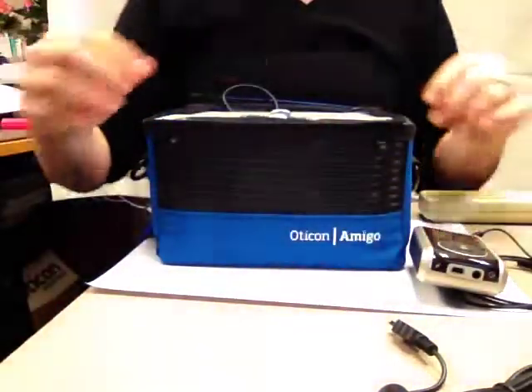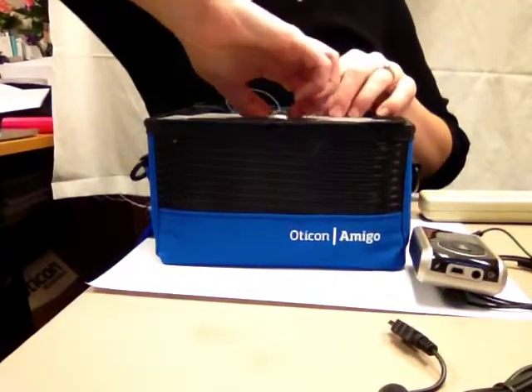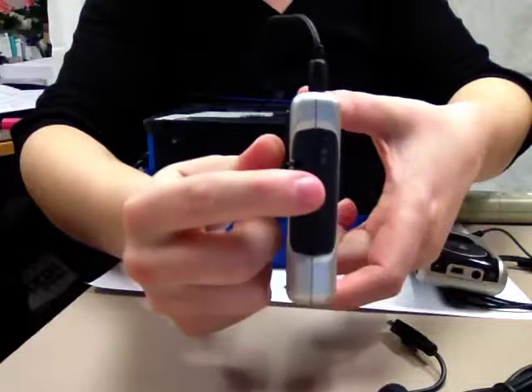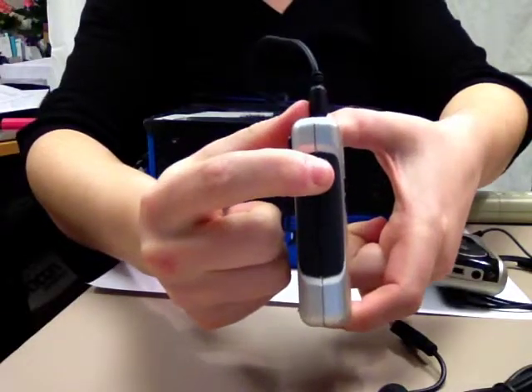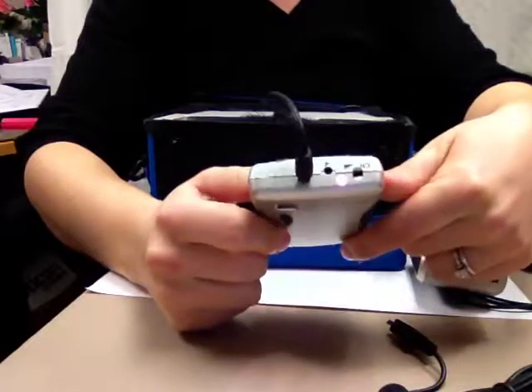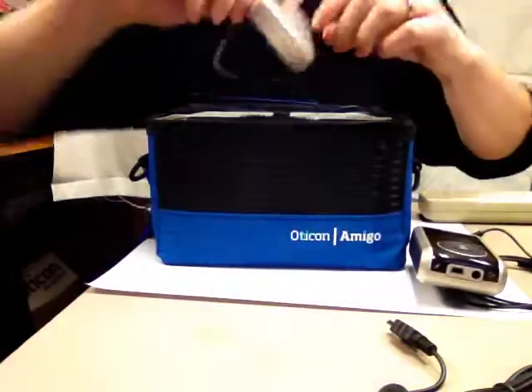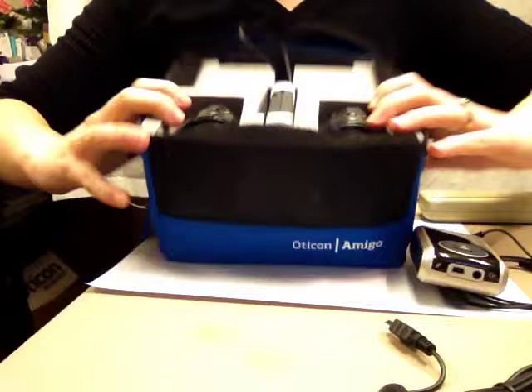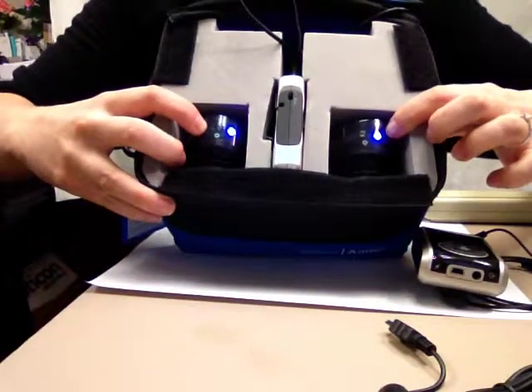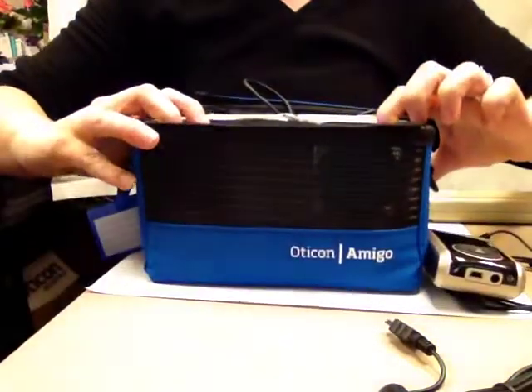Next, turn on the Oticon R5 receiver located in the Amigo Desktop speaker box by moving the slider on the side from 0 to 1. Turn on the Amigo Desktop speakers by sliding the switches on each speaker to the center. A blue light on each speaker will indicate that it is on and charged.